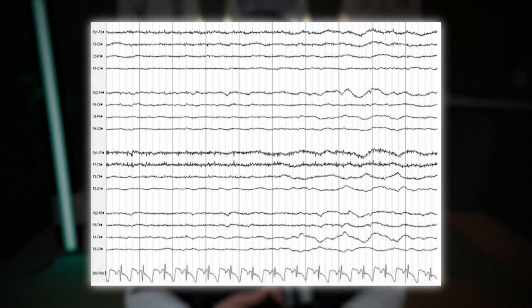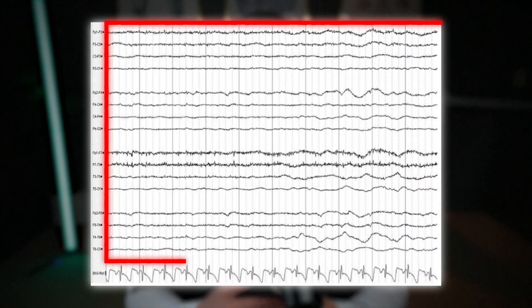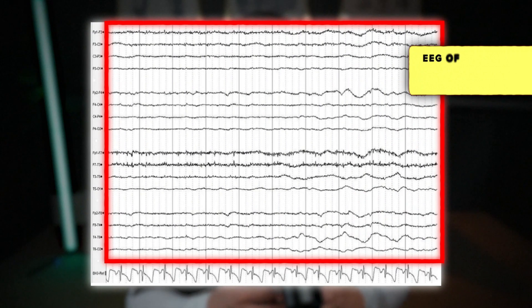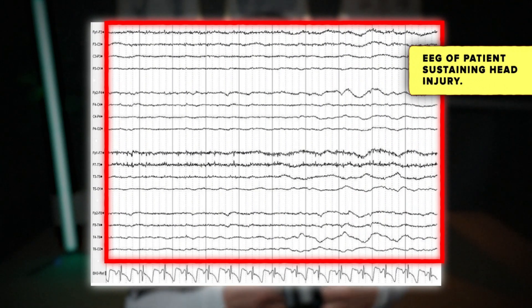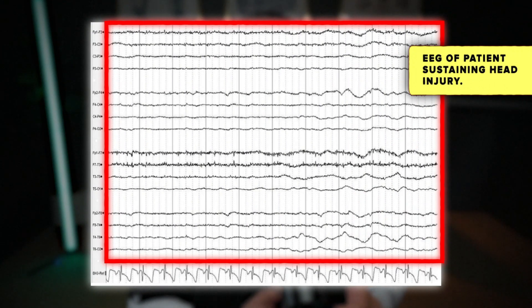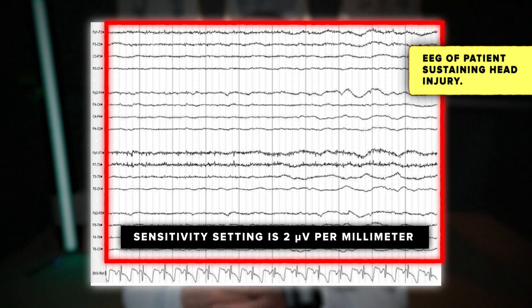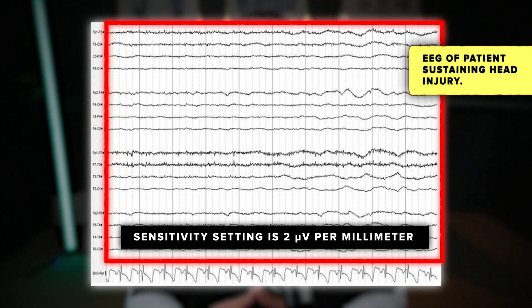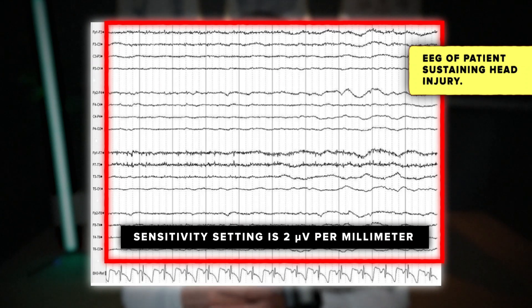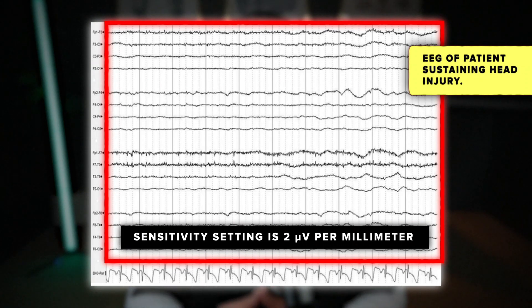In this EEG sample, we see a recording from a patient who sustained a head injury in a motor vehicle accident. The sensitivity setting is 2 microvolts per millimeter, and no waveforms exceed 20 microvolts in amplitude.